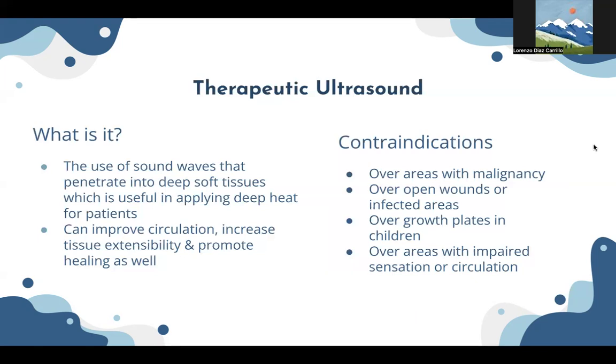But essentially, what it is, it's the use of sound waves that penetrate into deep, soft tissues, which is useful in applying deep heat for patients. So it can improve circulation, increase tissue extensibility, and promote healing as well, very similar to all the other heating options. However, this is a really great way to perform deep heat and get into those deeper muscles.